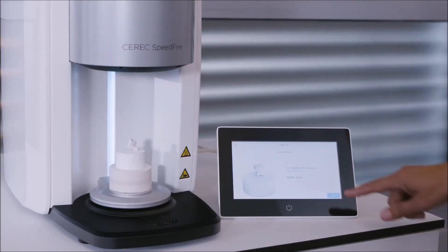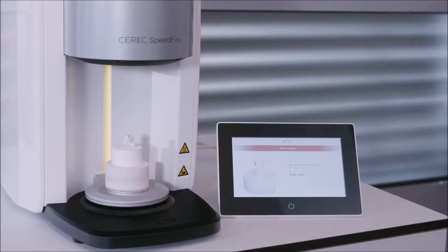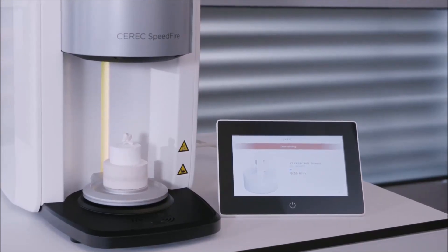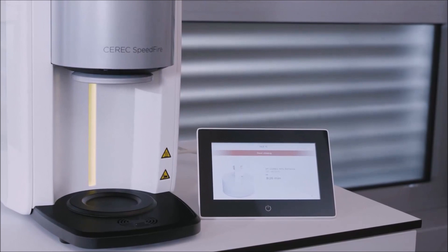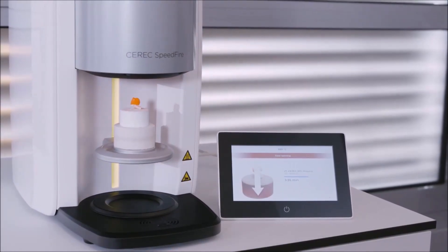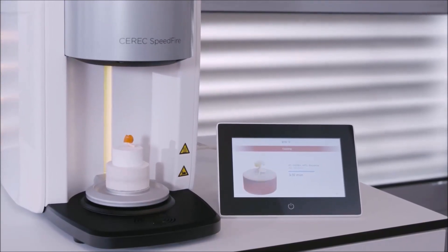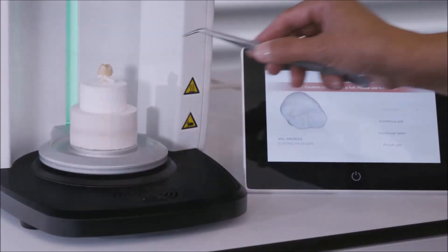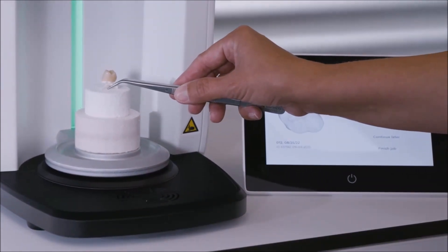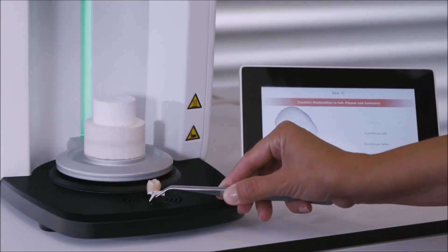Then we initiate the glaze firing and the door is closed automatically. After about 5 minutes, the door opens automatically. At this point, the restoration has a temperature of several hundred degrees Celsius. Only after the time on the operation panel has completely elapsed, we will place the pin and the restoration onto the fan for faster cooling.